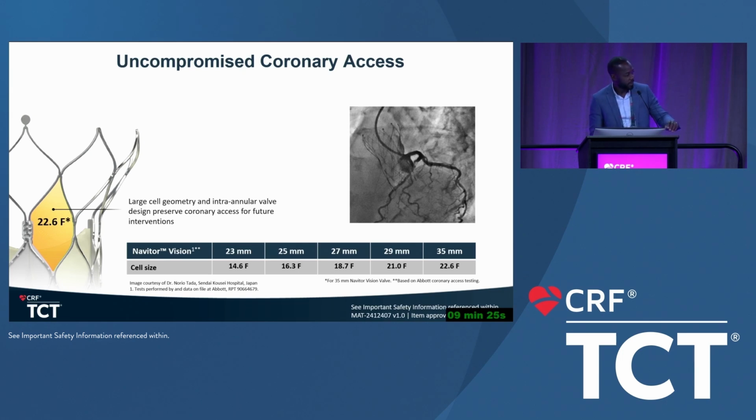Can I just make a comment, Didier, real quick? Yeah, please, Vinod. There are 2 things I wanted to say. One, Bassem, I totally agree with you. And you guys know this: cardiac surgeons will change to suit the cardiologists who are referring patients to them. So if your cardiac surgeon is putting in 19s and 21s, and you go back and look at that op note, I think you have to call them out on it. Inappropriate 21, 19, right? And I think if you stop sending patients to that cardiac surgeon who's not doing the root enlargement, it will change their practice, and they will step up and start doing it. So that's number one. If you have a nice professional dialogue, it will help the pathway, because that's not right to do.